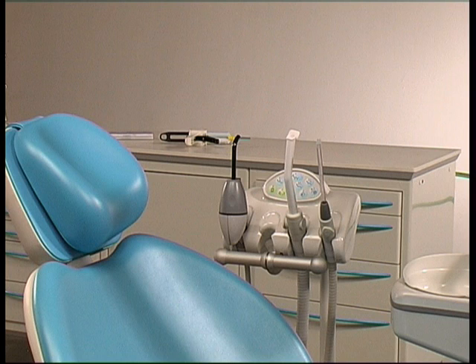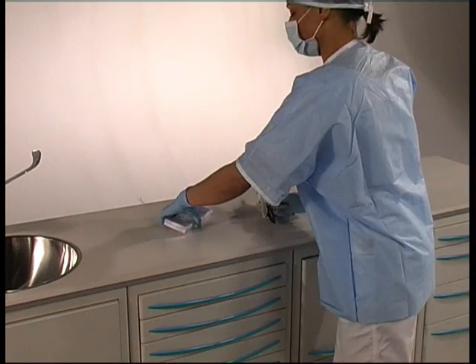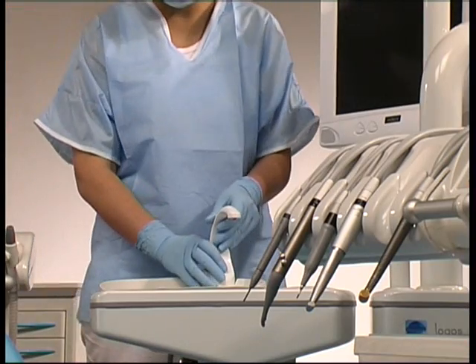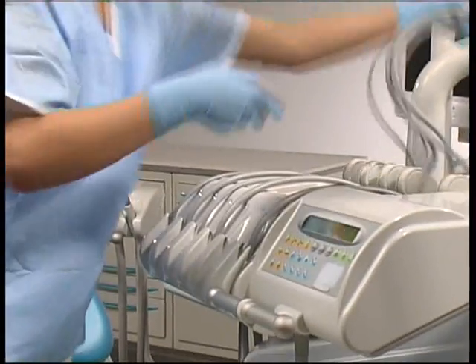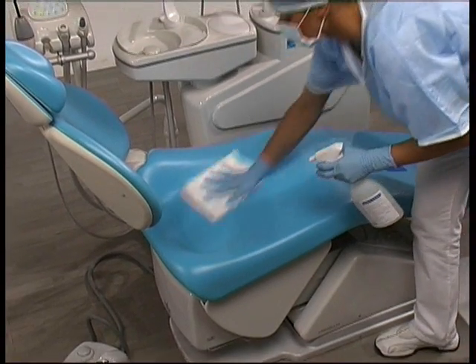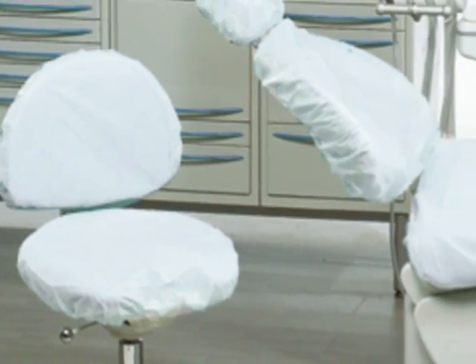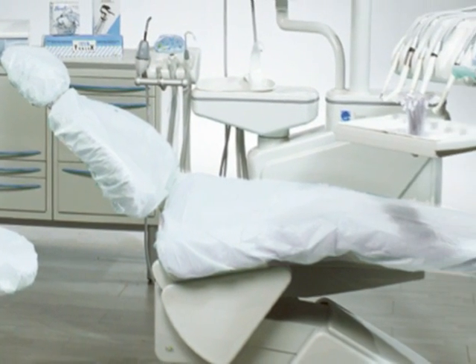The first phase involves the scrupulous cleaning of the working environment. A suitably protected assistant, wearing a mask, cap, goggles and disinfecting gloves, removes everything from the dental chair and the work surfaces that is not required during the operation. All surfaces are then cleaned and disinfected using suitable products. The various parts of the dental chair are covered with waterproof, disposable protective materials that act as a barrier. This operation allows us to drastically reduce the risk of cross-contamination.